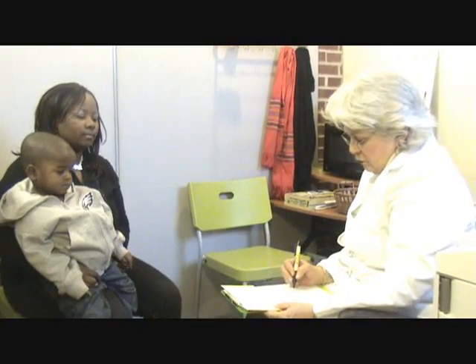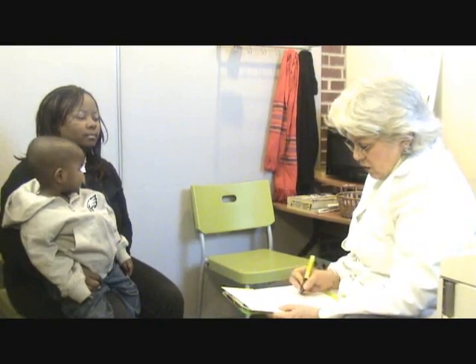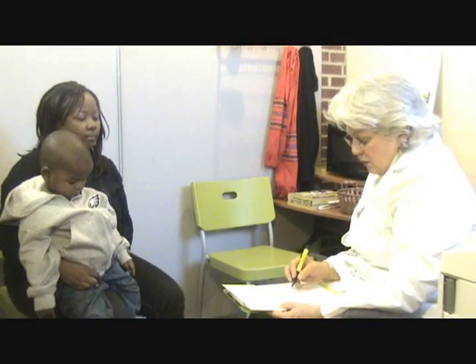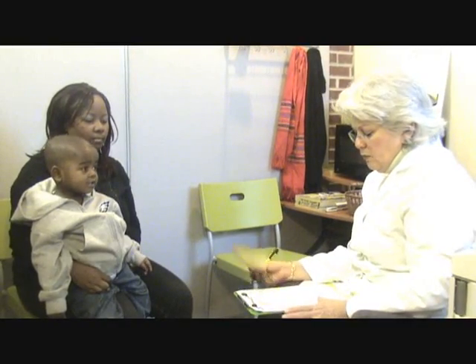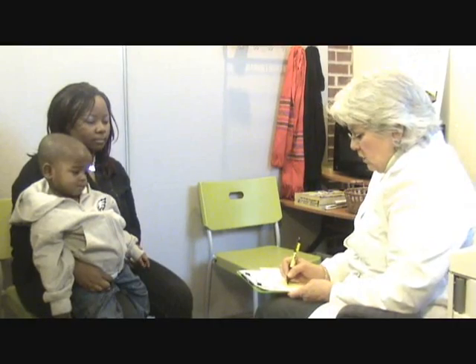This is a male — that's important for the child. We don't ask the race for the child until the father is ascertained. Trey has not had a blood transfusion or blood stem cell transplant. We do not need a social security number on children, and photo ID is not required, though it's helpful if there is ID. I'm going to sign that I collected your samples, Monica, and now I'll be collecting Trey's samples.